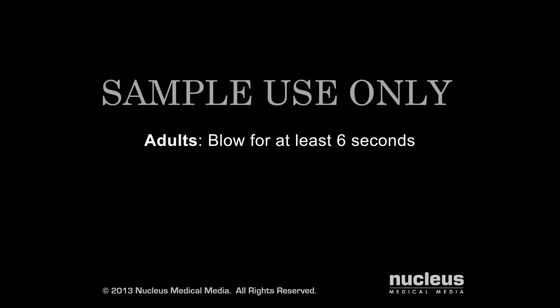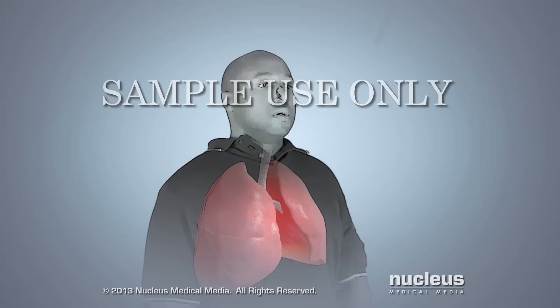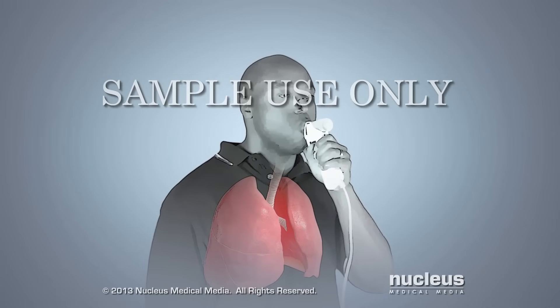If you are an adult, you will blow for at least 6 seconds. Children 10 years old and under will blow for 3 seconds. You will need to perform the spirometry test correctly 3 times to get accurate results.